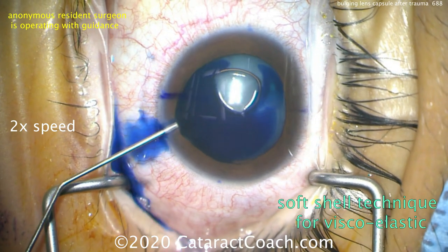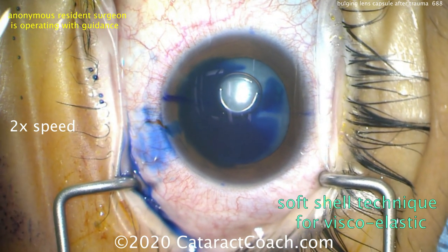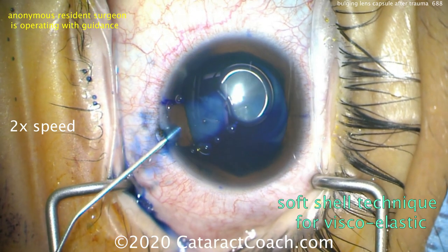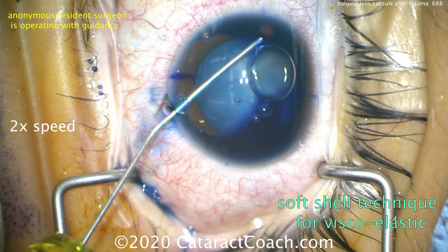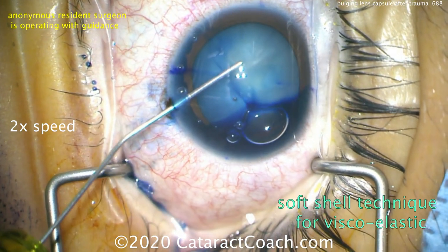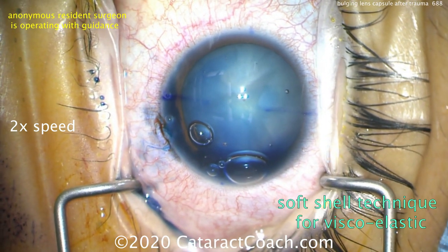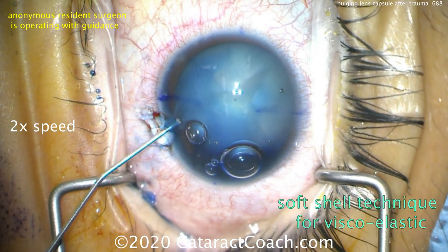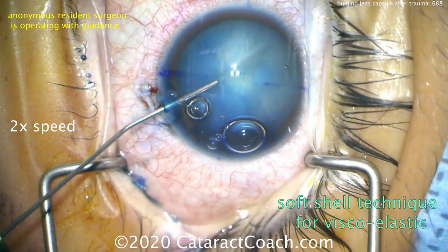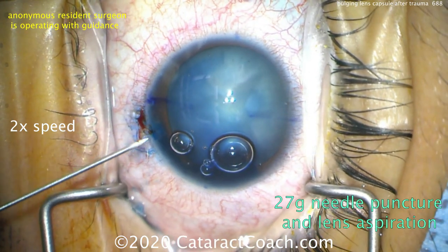We'll have to use TriPen Blue dye to stain the lens capsule. It's also going to help decrease the elasticity, because remember this is a 23-year-old patient and the capsule tends to be more elastic. Viscoelastic is being placed in the anterior chamber — our goal is to really pressurize the anterior chamber. We want the pressure in the anterior chamber to be higher than the pressure in the capsular bag, a soft-shell technique: first dispersive and now a little cohesive viscoelastic.